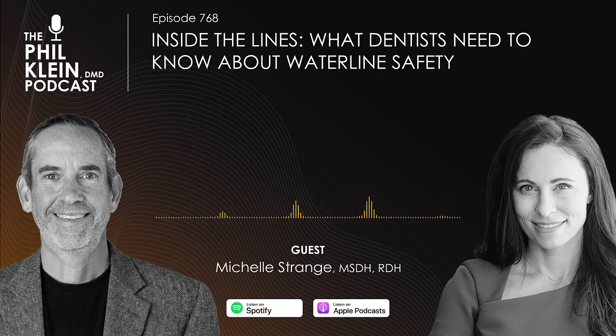And then I would say maybe somebody forgot the last time to shock a line that gets water. I think the slow speed handpiece is such a great example for this. It gets water, but not everybody uses water for it. And so maybe 3 months ago, when you were shocking, somebody just didn't do that one line. Well, it can still be breeding, and it can almost be like a feeder to the rest of the lines that will jump start that coater and floater situation in the biofilm.